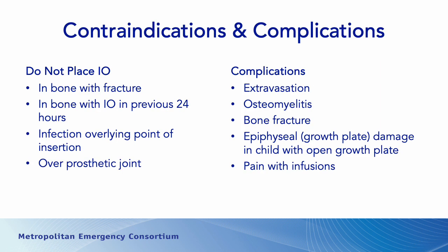So we should not place an IO in a bone that has a fracture. If you have a patient who appears to have a tibia fracture, well, that's not a great place to put the IO, because as you infuse fluids, they can leach out through the fracture line into the soft tissue.